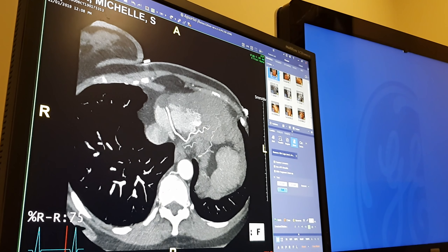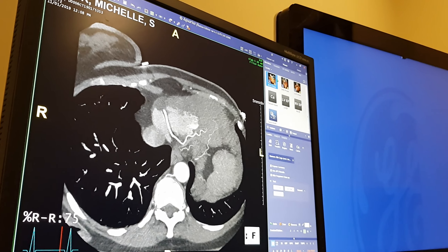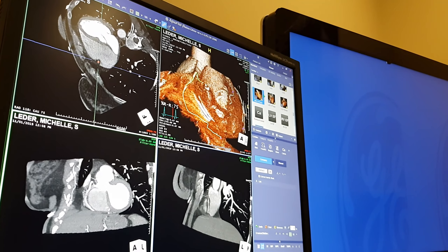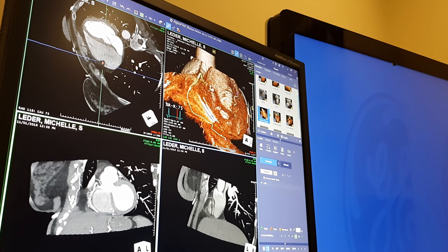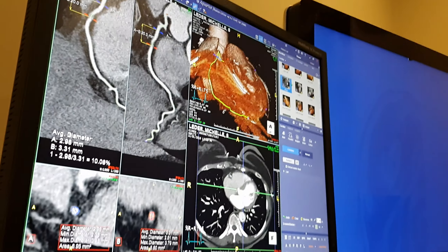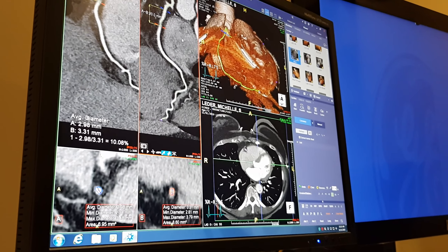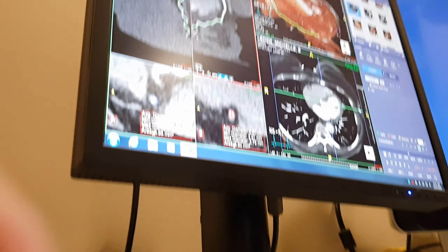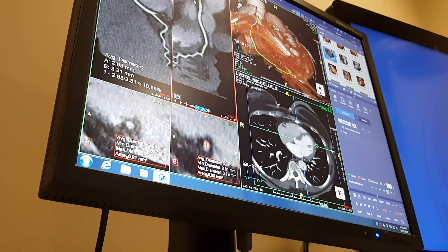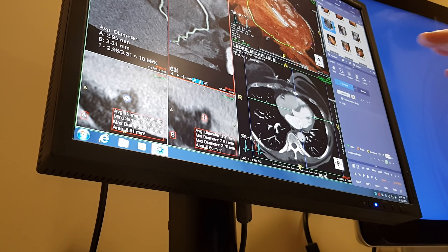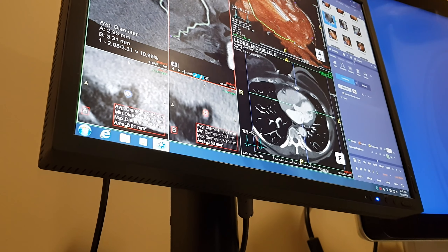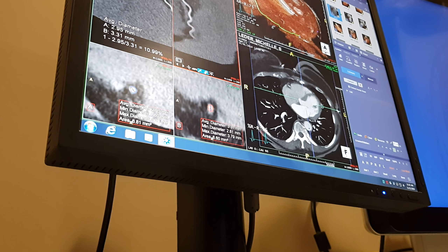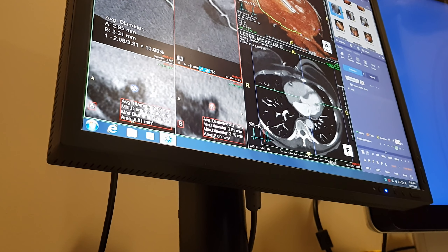Let's see if the computer is going to work today. That's just one artery — one artery. Okay, actually that's the RCA. Here we go — beautiful. The computer has now taken your whole right coronary artery and laid it out here for us, and we can rotate around it. That's where the two heartbeats get stitched together.